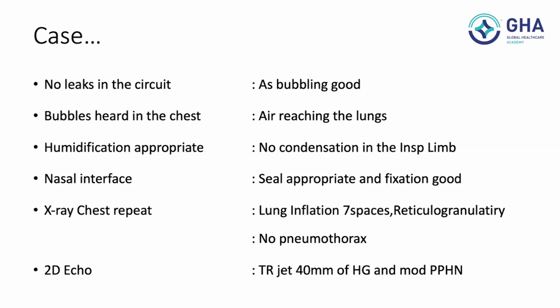The nasal interface should be snugly fitting. Mask or Hudson prong, snugly fitting. Ram's cannula, some leak around the nostril should be there. Seal should be appropriate. Fixation should be appropriate. The prong should not be hurting the baby. The weight of the prong should not be on the baby's nose. So you need to support the tubings, as seen in the video, with some amount of gauze or a bed sheet tied up, and then give support to the interface. And repeat the X-ray and look for pneumothorax and lung inflation.